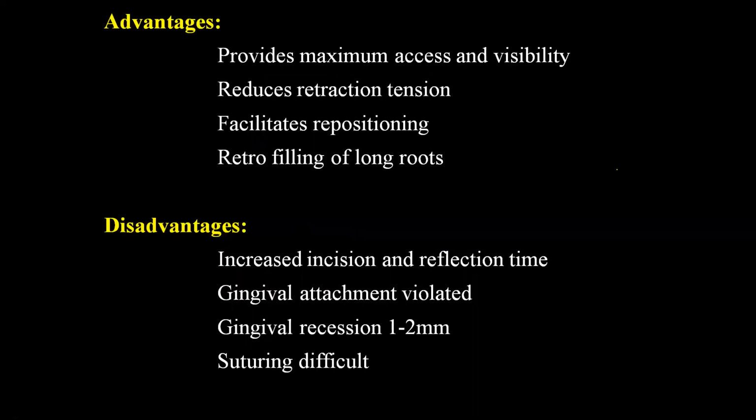So advantages: it provides maximum accessibility and visibility, reduces retraction tension, facilitates repositioning because it's anterior teeth. Repositioning is very important. Retrofilling of long roots. Disadvantages: because it is a long flap, gingival recession, suturing, everything is sometimes a problem.